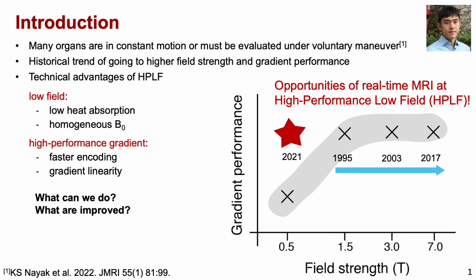In the next part, I'm going to start with these technical advantages and introduce some of the effort we have been doing to improve the real-time imaging capability at our high-performance low-field systems.